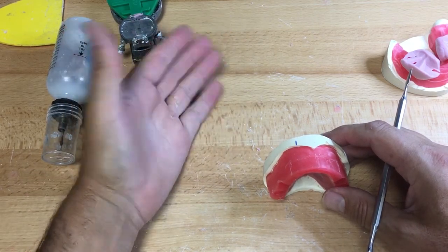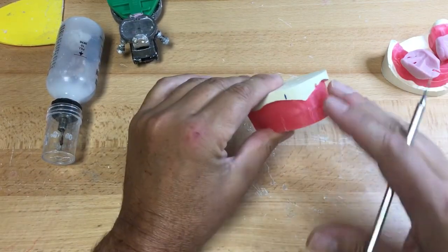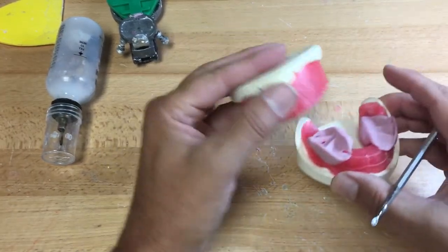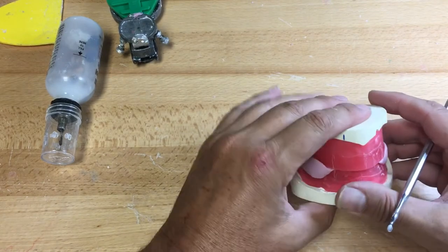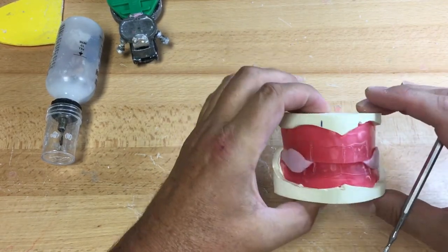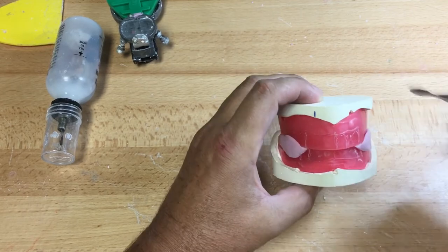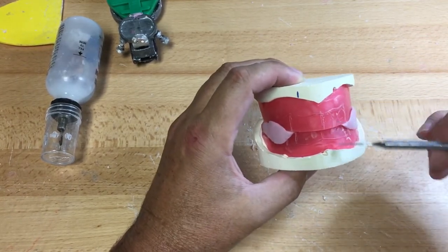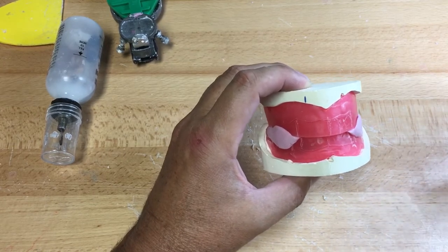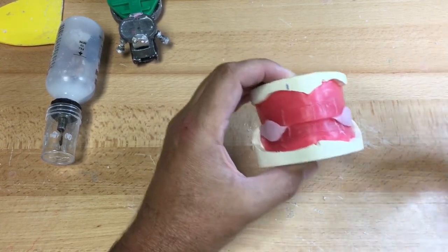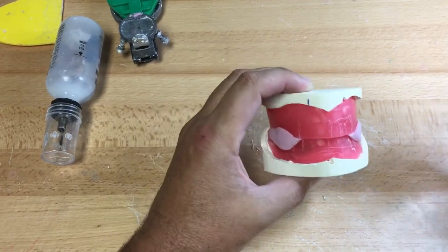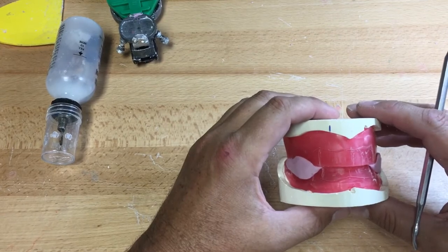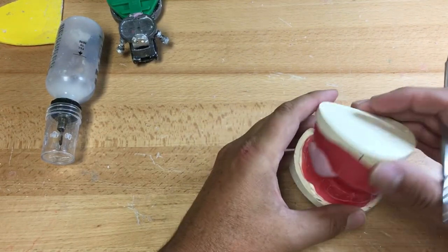If we can't handle the wax in an occlusion rim, we're going to have a very difficult time handling the wax in a denture setup. So like I said, I trim the bases. Once I get them back, if they're not equal, doesn't have to be perfect, but very close. Base, plane of occlusion, base.